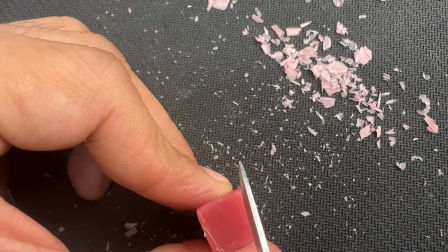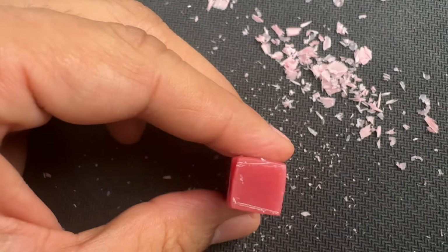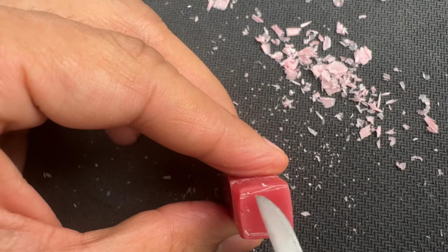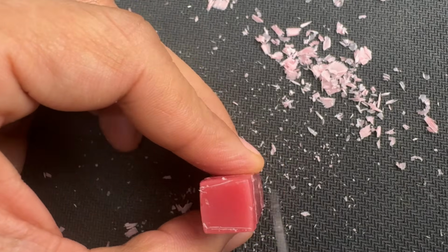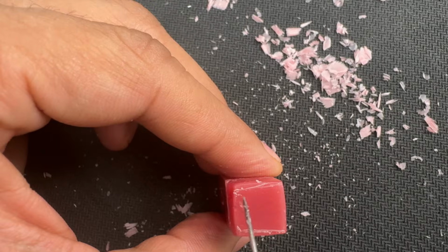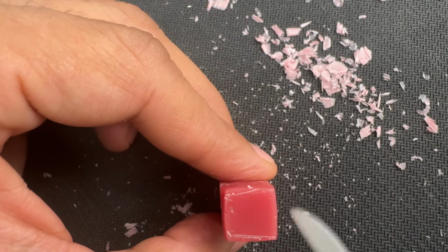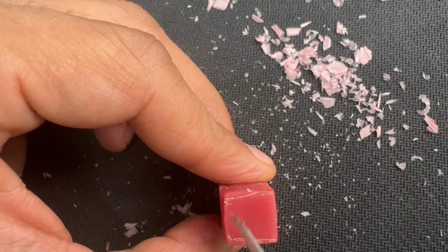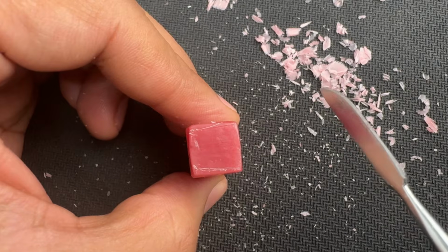See how the tooth is converging. I just drew a slanting line. This is distal, remember, this is mesial, and you see how the tooth is converging distally. So this is narrower on the distal side, broader on the mesial side. So that needs to be established.